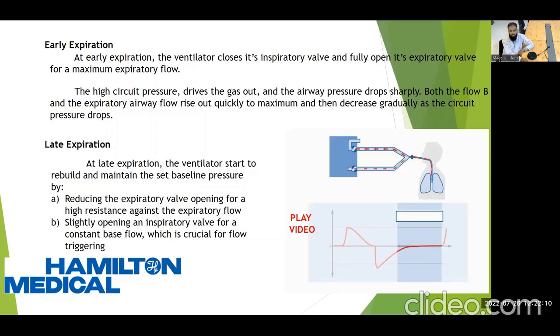Then, when the expiration is going to end, the expiratory valve will be closed and then the next inspiratory phase will start.